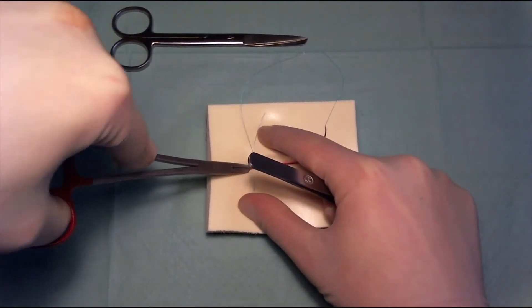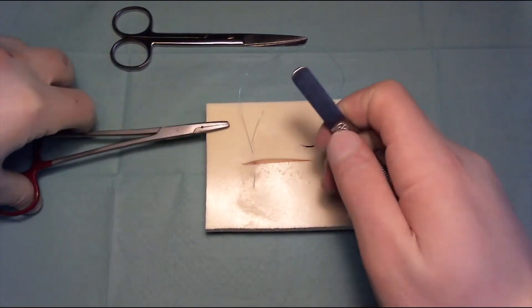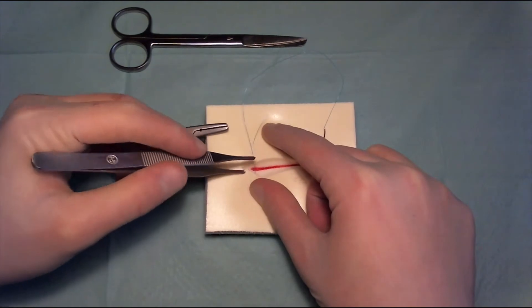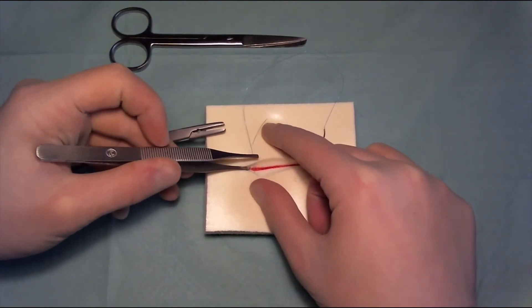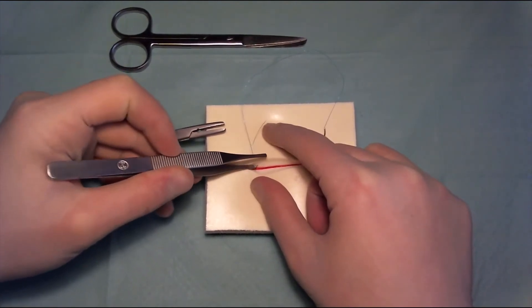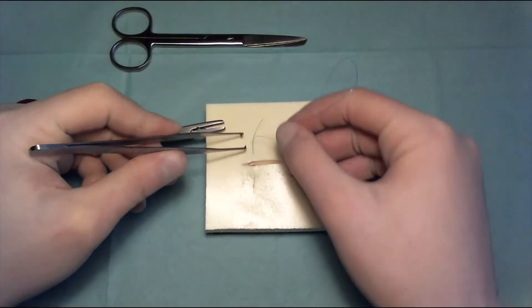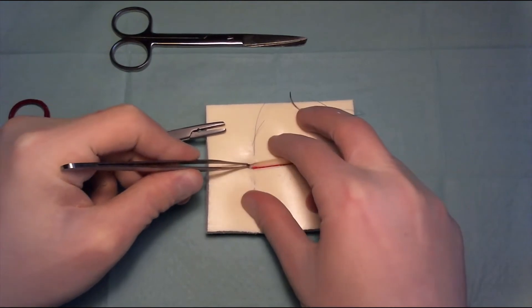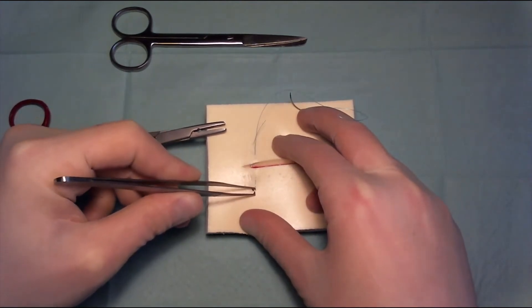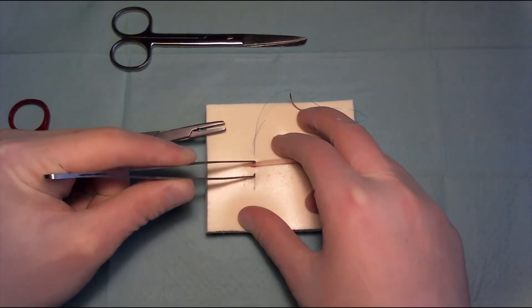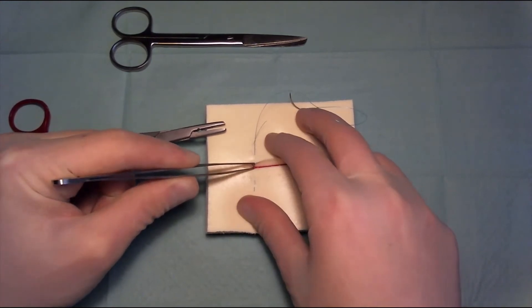The important thing is that you have two levels of suture. The first one went deep and far, which is the one over here. The last one is superficial and close. So the first one starts over here, goes deep, stays deep, and comes out far. Then the next one is closer to the wound edge, more superficial, and stays close to the wound edge.